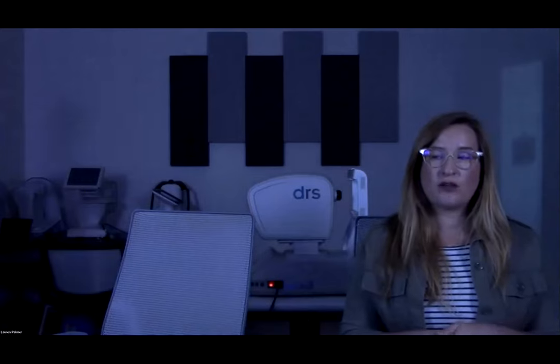Okay, so I have a question here about the Remidio fixation for external fixation. If you remember, those cameras have a sliding dot on a bar on the outside of the camera. With those devices, the ideal place to start is with that dot all the way against the camera barrel. So you want to place the bar horizontal at 90 degrees and then slide the dot as close to the camera as you can. Lauren got that device for us.